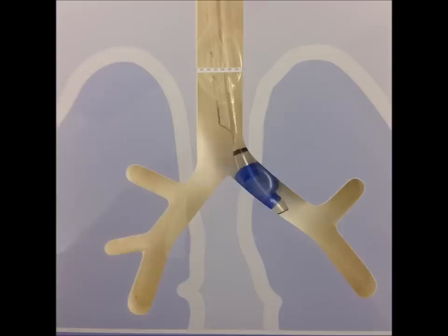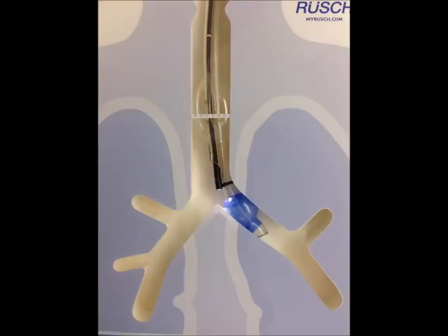You can ventilate through the tracheal port. You can ventilate this way. If you want to ventilate the left, you do that. If you want to ventilate the right, go through the tracheal port. Always pass the bronchoscope through the tracheal port when it's seated properly. This way you can visualize the carina nicely. You can see just a little bit of this pillow of the endobronchial balloon just distal to the carina, and be prepared that when you move the patient into the lateral position, that this can move.